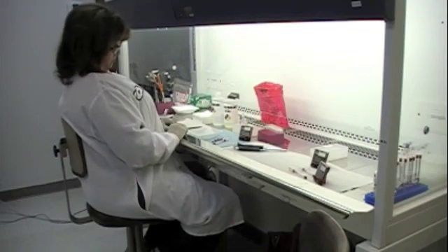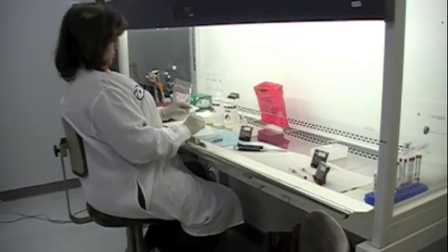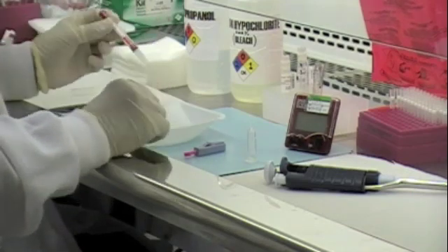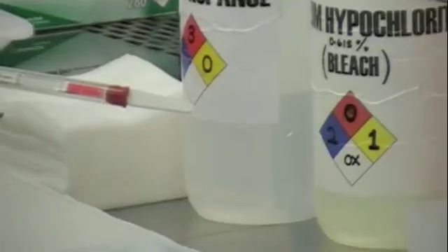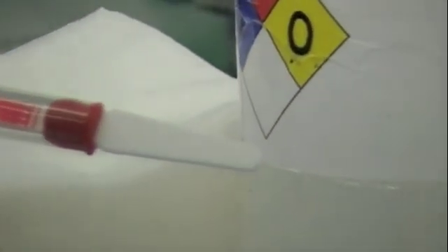Since the blood and all components are set and ready, we can start the test right now. First, remove the HIV express device protective cover. Please identify on the express test the minimum and maximum fill lines located on the sample pad — that is the sample pad right there, where we will see both the minimum and maximum fill lines.